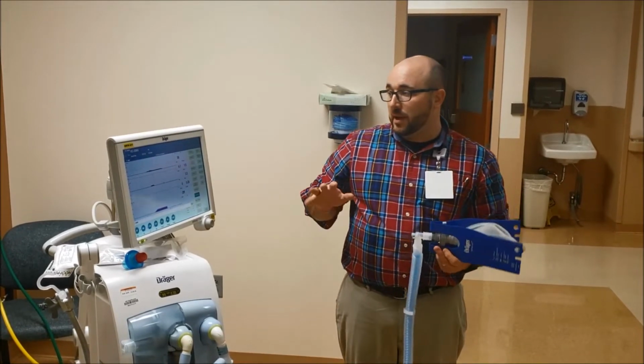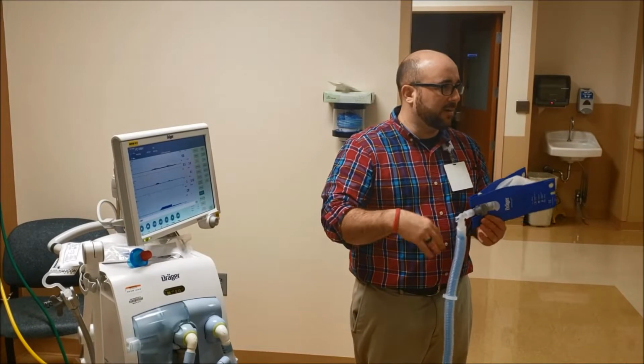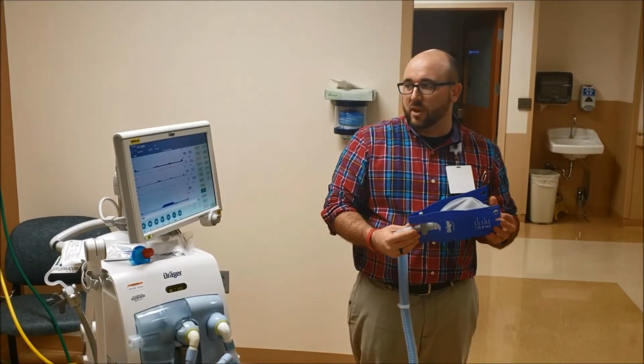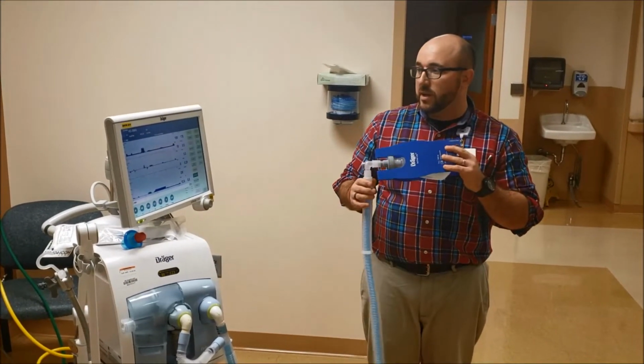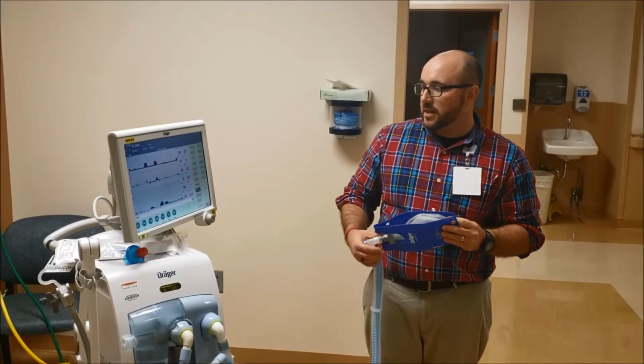But when you connect them back again, it senses them, and what it does is a final O2 enrichment. So it gives them a couple minutes, I think, of 100% oxygen, just kind of a recovery type thing, and then it'll go back to normal settings. So actually, it is 2 minutes. It's 120 seconds. It restarts the timer again. So right now, it's going and doing great. So that's a great way to suction. That's a great thing to use.